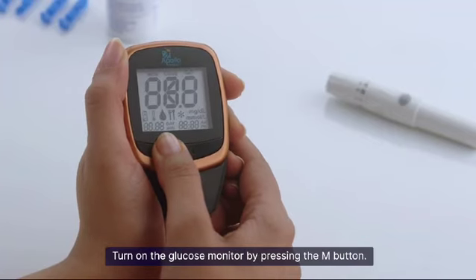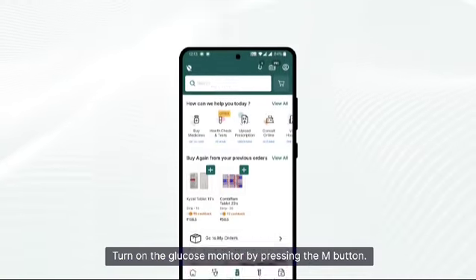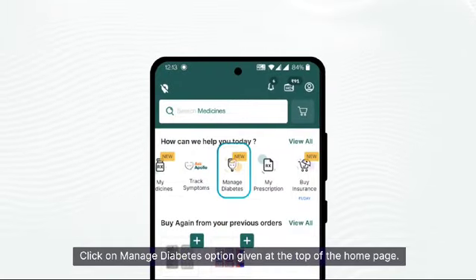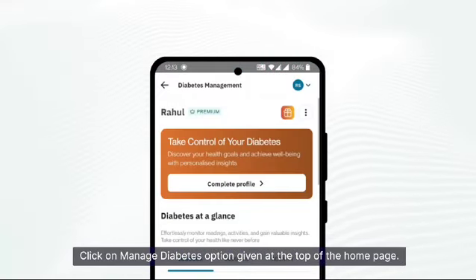Turn on the glucose monitor by pressing the M button. Also switch on your phone's Bluetooth. Click on the 'Manage Diabetes' option given at the top of the home page.